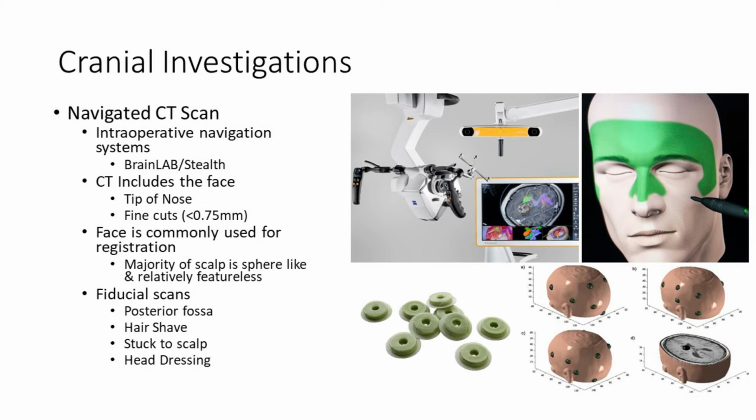So that's for helping with software called either Brainlab or Stealth, depending on which type of software people use. In theatre, if you want sub-millimetre accuracy and you want to make the perfect opening, as small as possible, and reduce the wound size, and get into exactly where you want inside the head, because the head is clearly very spherical, sometimes it can be a little bit tricky.